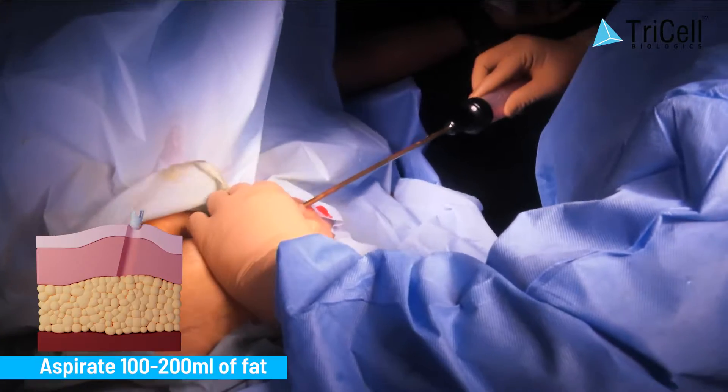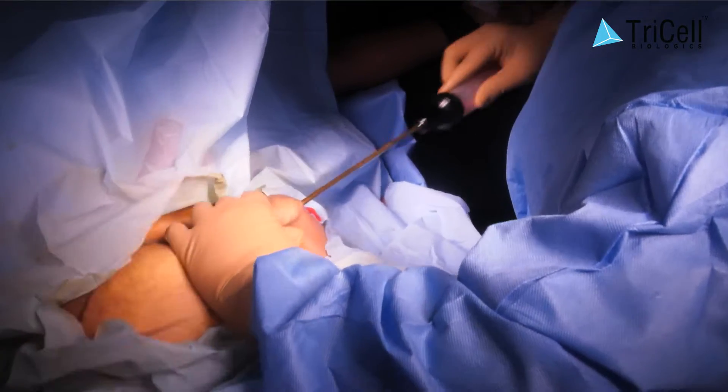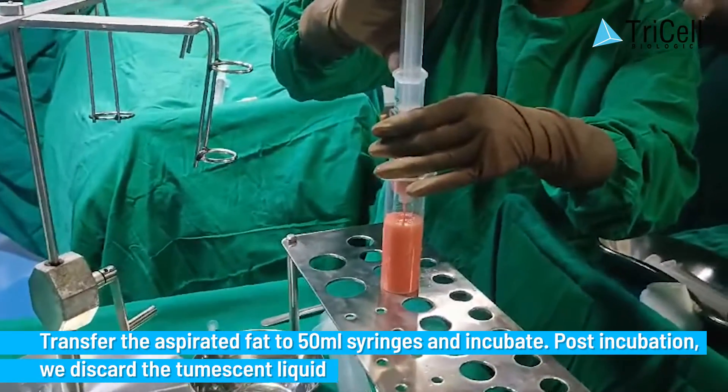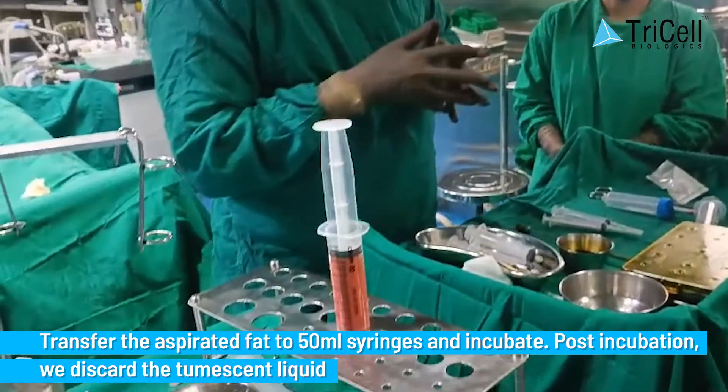Step 1: Aspirate 100 to 200 milliliters of fat. Step 2: Transfer the aspirated fat to 50 milliliter syringes and incubate. Post incubation, discard the tumescent liquid.